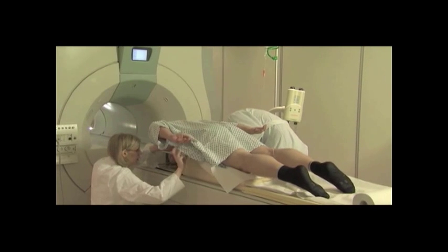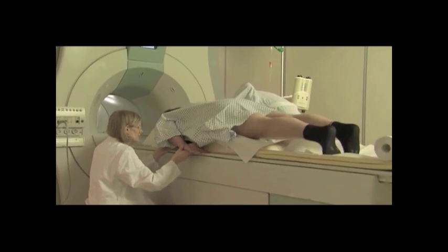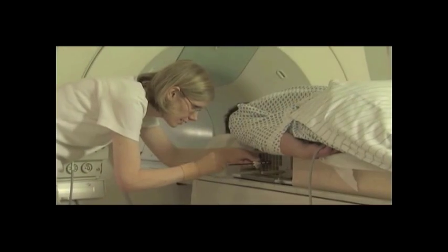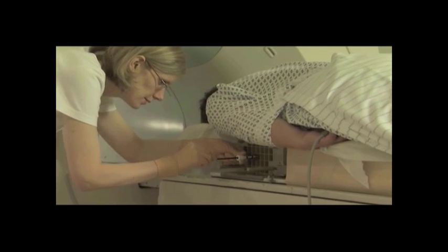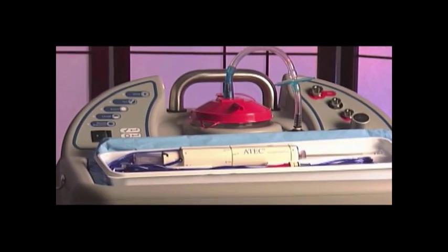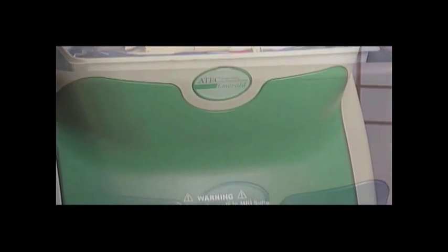MRI breast screening is a recommended secondary screening method for high-risk women in addition to mammography. MRI-guided breast biopsy is a minimally invasive option for diagnosing the clinical outcome of suspect lesions identified by MRI. The Suros Atec Sapphire and Atec Emerald Breast Biopsy systems are designed for this procedure.